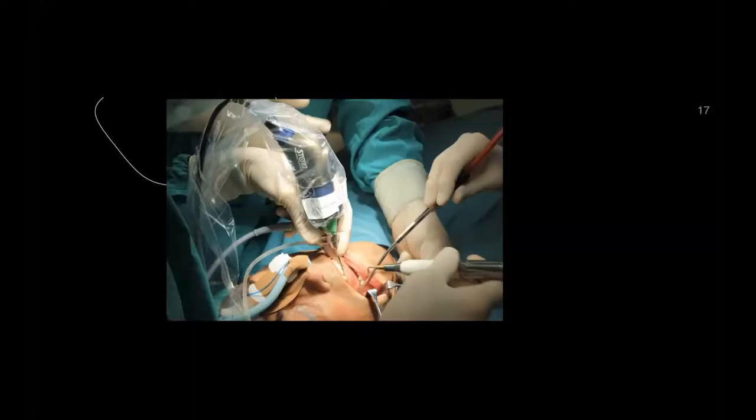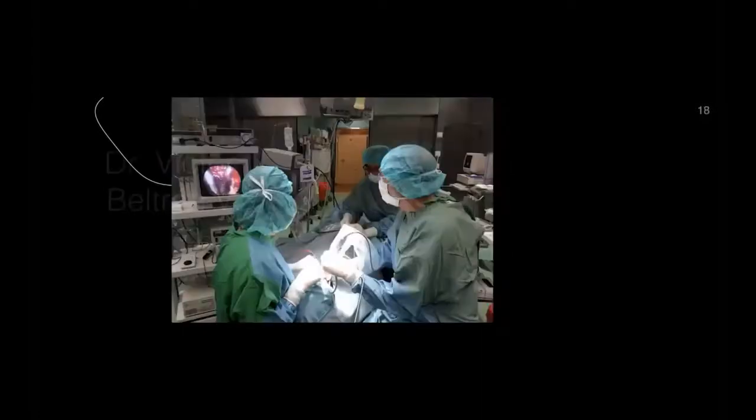It is possible to observe that the operator is working with a piezoelectric tip in his dominant hand while holding the endoscope coupled with the camera in the other hand. The assistant is tasked with suction, irrigation, and separation within the surgical field. As you can see, this particular patient is intubated for general anesthesia.